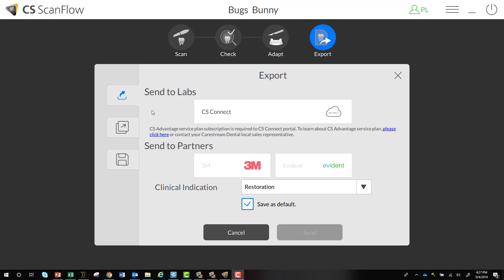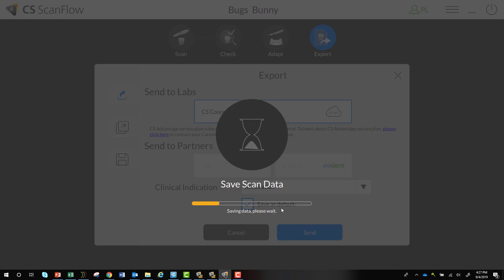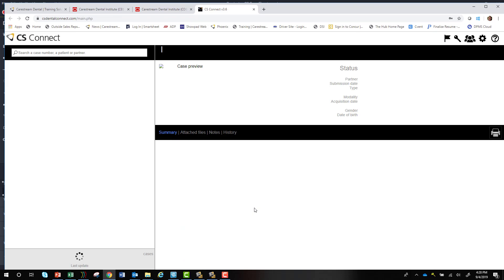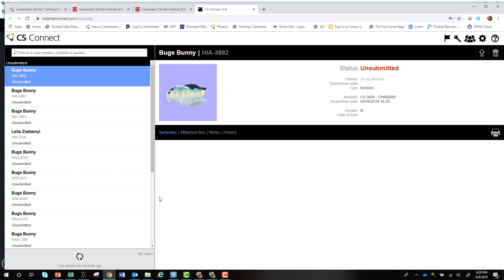To send the scan through CS Connect, select CS Connect, highlight it, and select Send. It will automatically save the scan in your patient record and automatically launch CS Connect so you can send it to the lab. You don't have to log in with credentials because we already did that earlier and we're staying logged in. Submit your case through CS Connect and you're good to go.